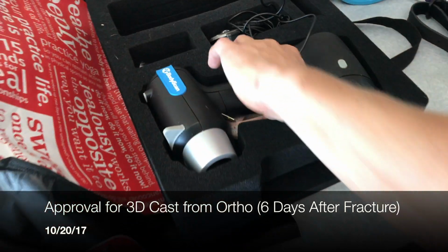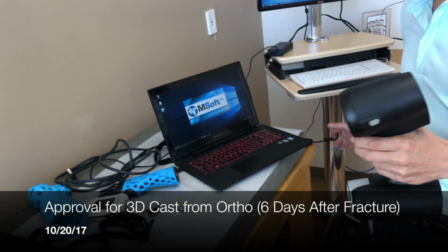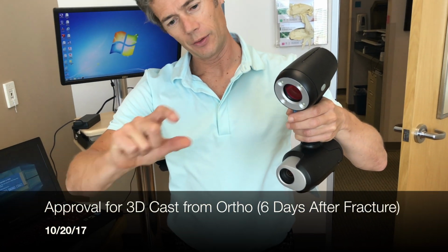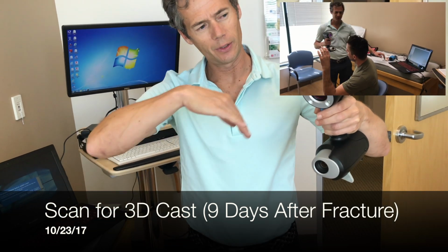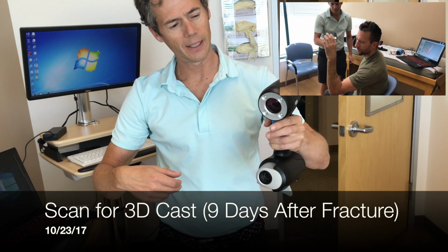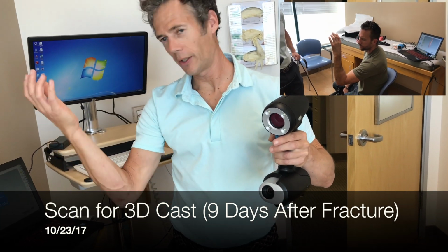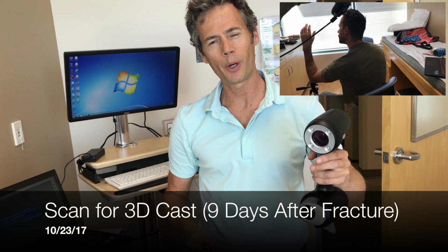Yeah, this is the scanner, as we call it. It fires 2 beams, and the apex right around here. And so when those 2 connect, that's where it's going to measure. It's going to be a grid point. I'm going to rotate it all around your arm, up inside your palm, and then capture a 3D image of your arm. And then we'll model it on here. If it looks good, then we send it off to the printer.